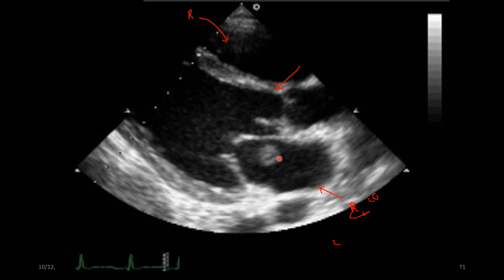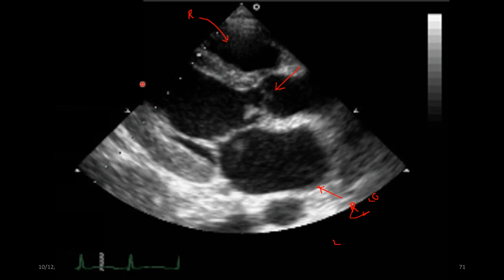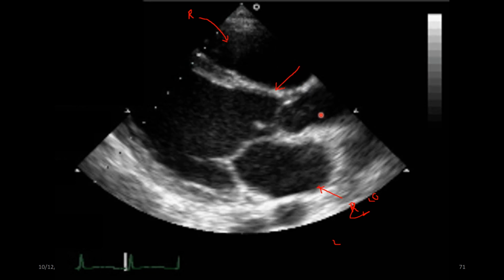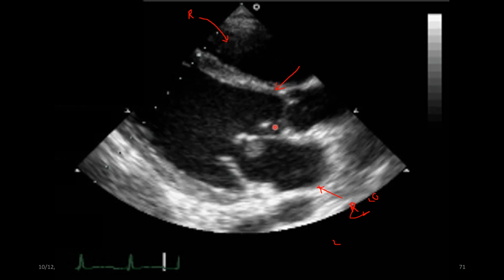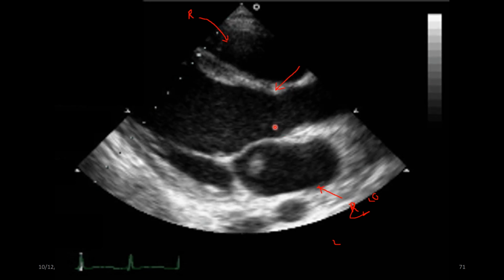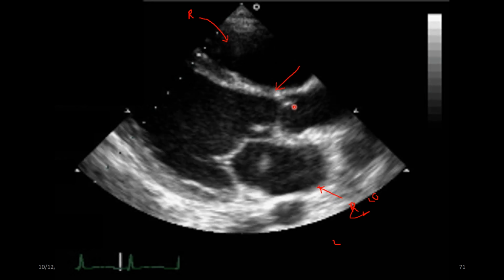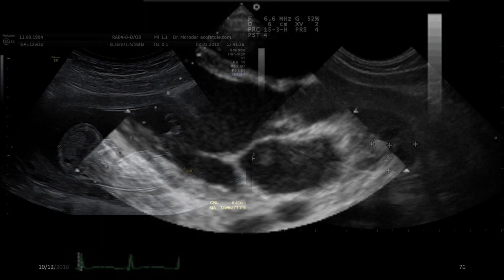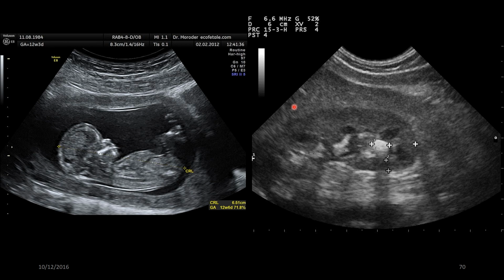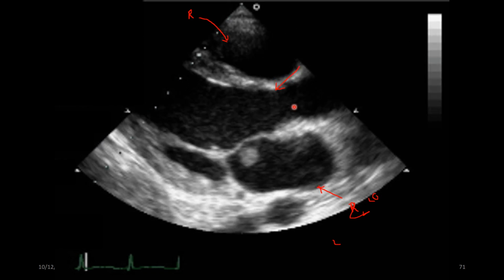And what you're seeing here is the valves of the heart opening up. So there's blood passing out into the ventricle, boom, out into the aorta. And what's happening here? You've got vegetation growing on the heart. It's endocarditis, and it's what happens when bacteria build up on the valves of the heart. And that's it, really. I can continue to show you many images of ultrasound, but that is it in a nutshell. I do quite like cardiac ultrasound, though.